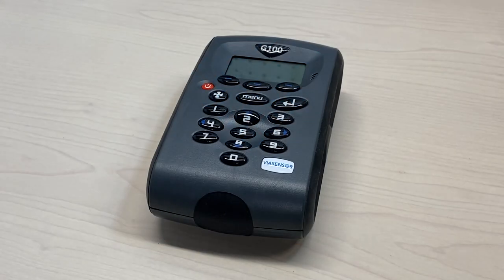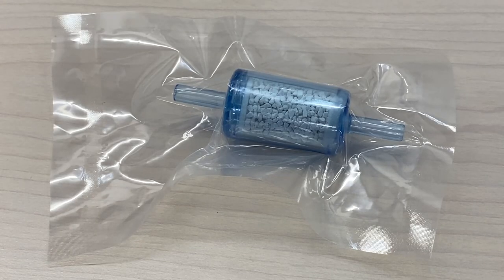Today we will demonstrate how to zero your ViaSensor G100 instrument using the SodaLime filter kit.